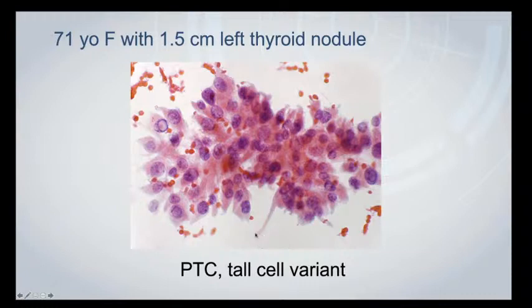And a clue to that might be in this one cell here at the bottom in particular, which has this very tall cytoplasm. But then again, if you look carefully at the others, you'll begin to appreciate a bit of a tall appearance in others as well.